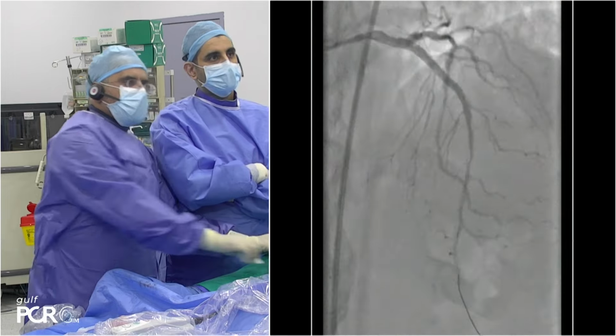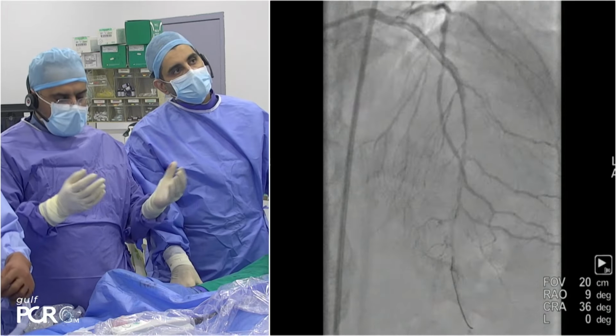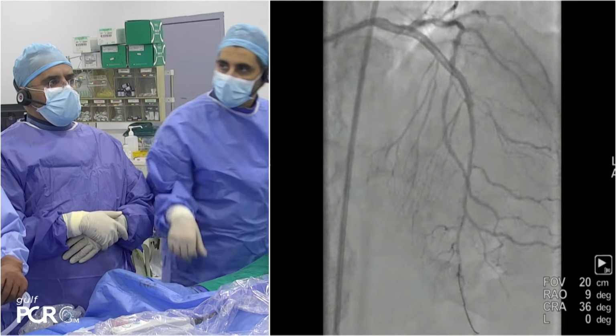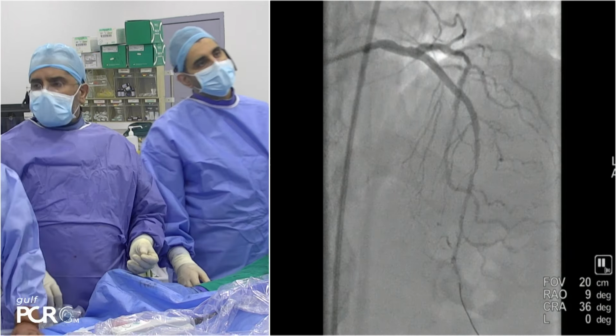Well, there was no big dissection there, to be frank with you, at the edge of the stent. It's clots in the stent, and the stent was underexpanded. So after the post-dilatation here, we can give you another run of OCT if you like. Let's go. Yes, show me. That's the last one.